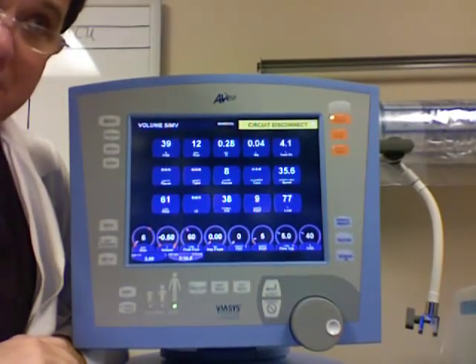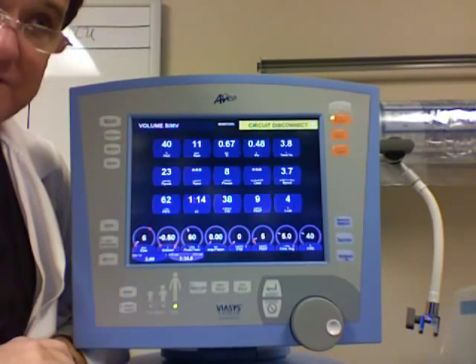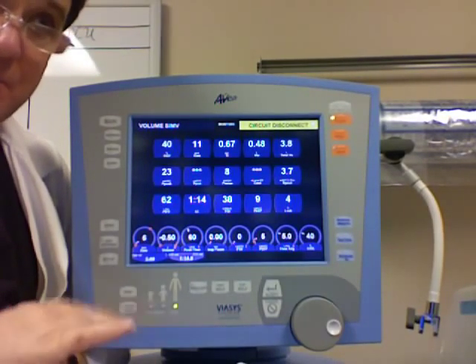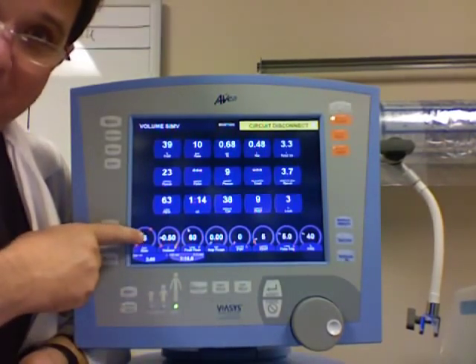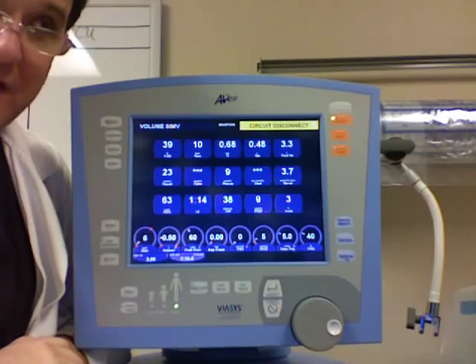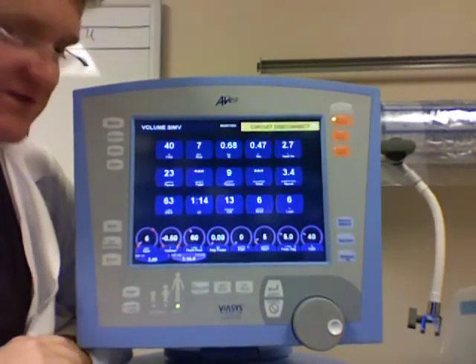SIMV is an intermediate mode. It's called synchronized intermittent mandatory ventilation. The reason they use that word synchronized is, let's say it's monitoring their spontaneous breathing and the patient has just taken a spontaneous breath, but the rate says it's time for one, it's going to wait. It's not going to breath stack and throw a breath right on top of another breath. It's going to protect the fact that they're already in a breath by monitoring it and not breath stacking.